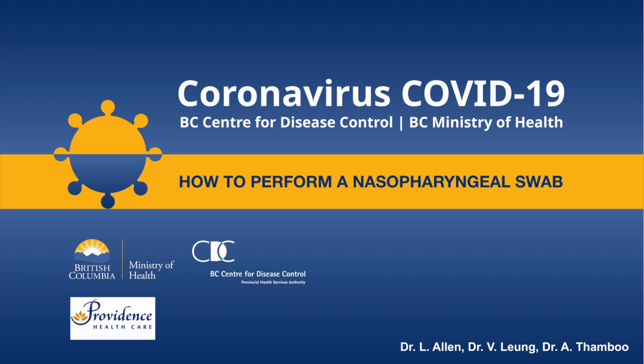This is a video on how to perform a nasopharyngeal swab. This video is a collaboration between the BC Centre for Disease Control and the Ministry of Health of British Columbia. The purpose of this video is for aiding in the diagnosis of COVID-19. This video focuses on the proper technique for performing a nasopharyngeal swab.